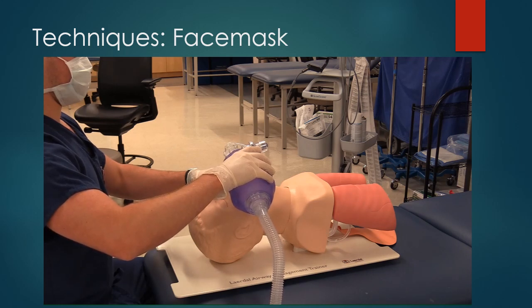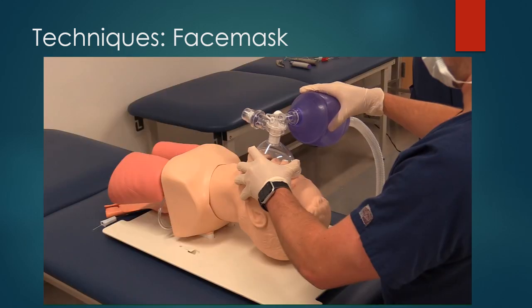Additionally, you want to make sure that the mask has a seal with the face without forcing the mask down. It's more of pulling the face up and into the mask rather than forcing the mask down onto the face. Importantly, also make sure that the mask starts at the bridge of the nose instead of lower down. A lot of times it's easy to focus on the mouth and forget the nose is also going to be helpful as long as it remains open.